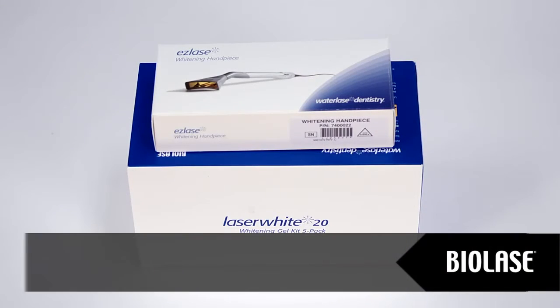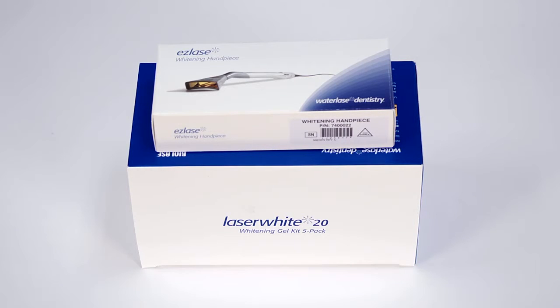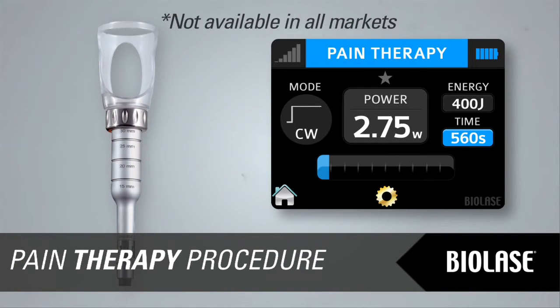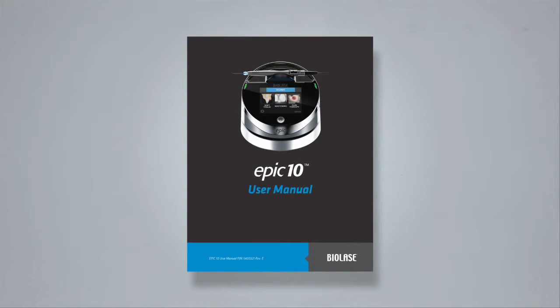To perform teeth whitening with Epic requires a whitening handpiece and Laser White 20 whitening kit. Please refer to the instructions that are provided with the Laser White 20 kit. Epic is designed to provide near-infrared laser energy to a tissue surface for the purpose of temporary pain relief when applied with a deep tissue handpiece. For more complete instructions on the pain therapy procedure, refer to the Epic user manual.